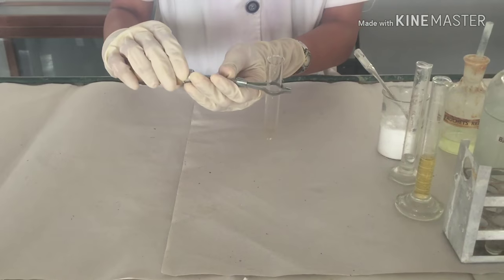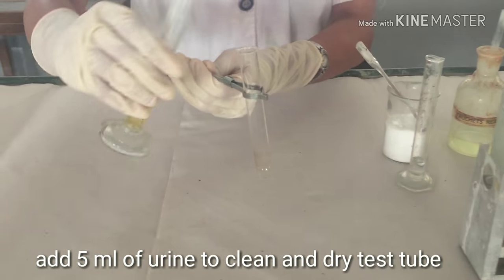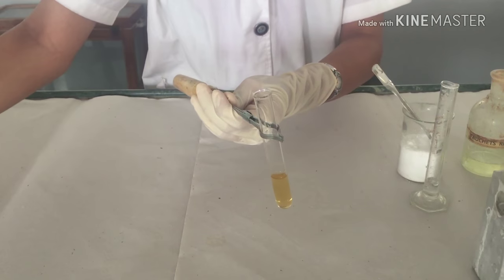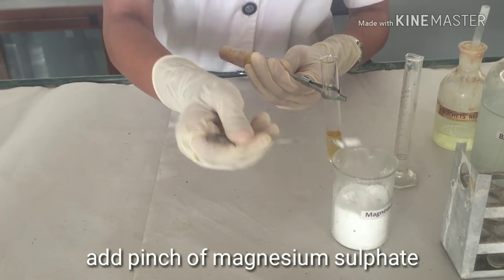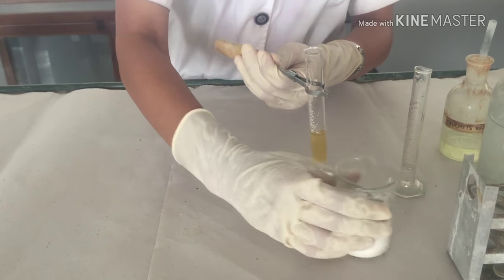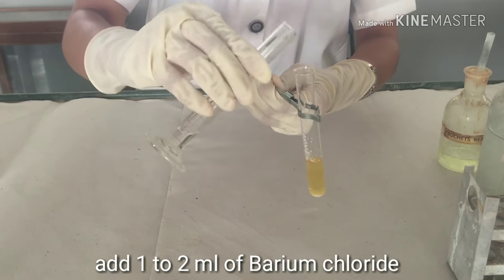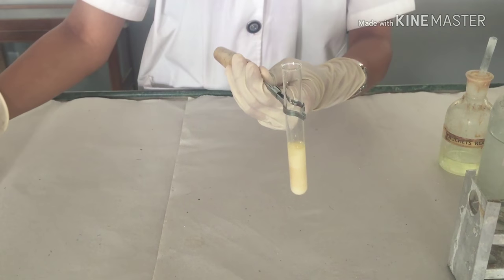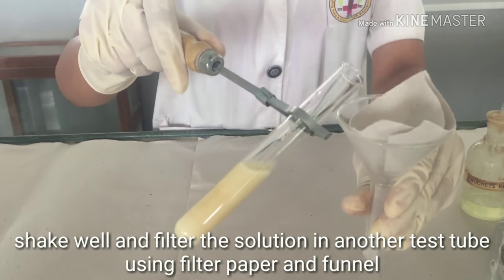Take a clean test tube and hold it firmly with the test tube holder. Add 5 ml of urine sample. To it, add a pinch of magnesium sulphate and add 1 ml of 10% barium chloride. Filter the contents.